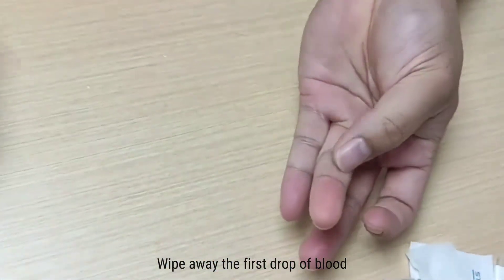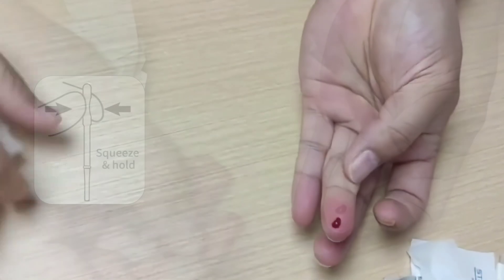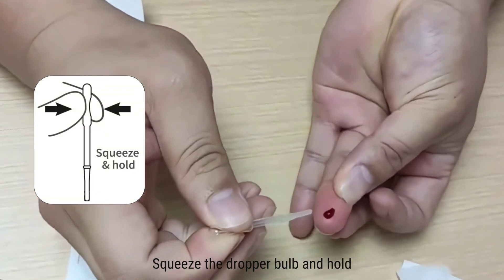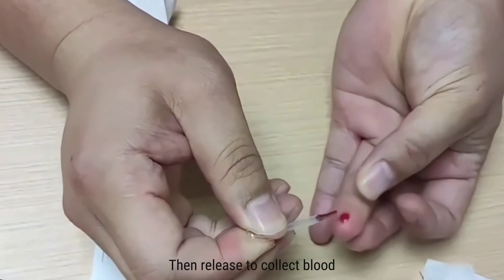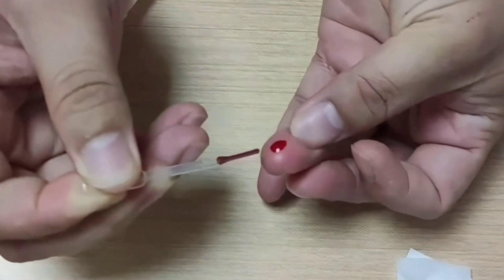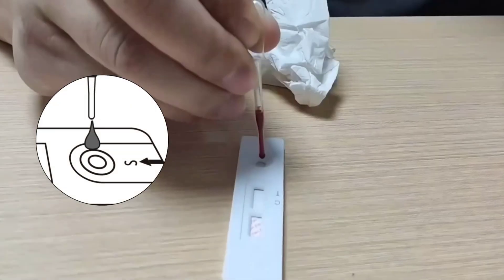Wipe away the first drop of blood. Massage the finger to create a whole drop of blood. Squeeze the dropper bulb and hold it, dipping into the blood, then release to collect blood until filling the dropper up to the mark line.